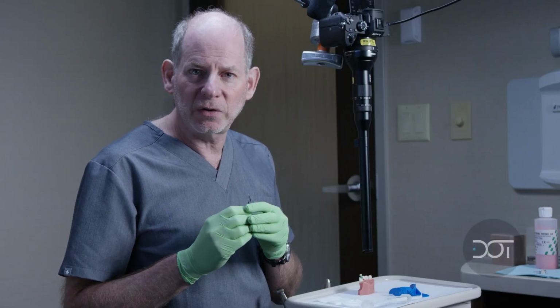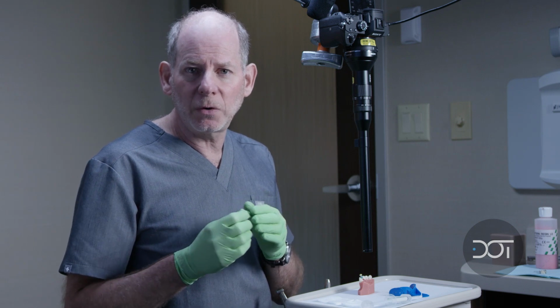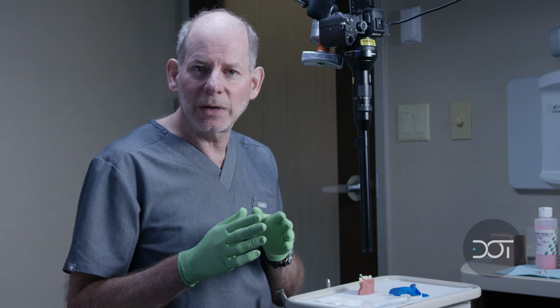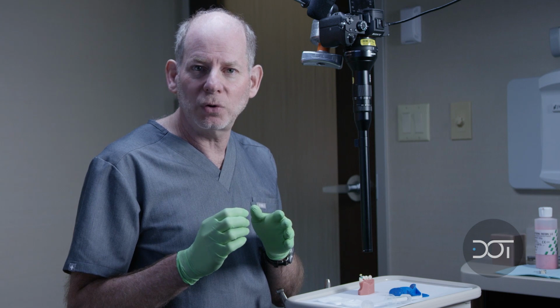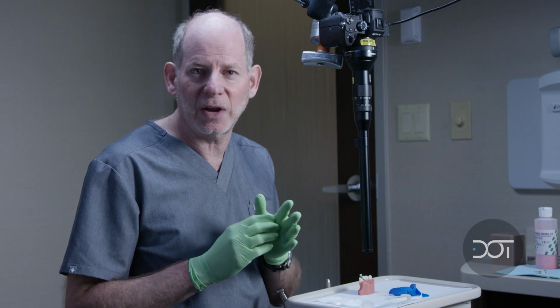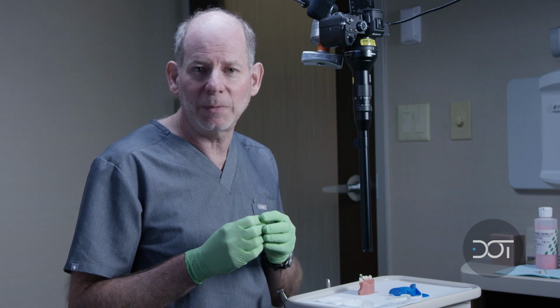Now think about the impression for a second. With the implant impression, we need to be able to capture that impression with two different materials. The first material is going to be a low viscosity or a higher running material, our highly flowable impression material. I need that so I can capture the gingival architecture, the soft tissue, and I also need to be able to capture the facial surface texture, especially on these anterior crowns, or for this anterior implant, to match the anterior teeth. That way my laboratory technician can look at the surface texture and the details, and for that we need the low viscosity or the highly flowable impression material.